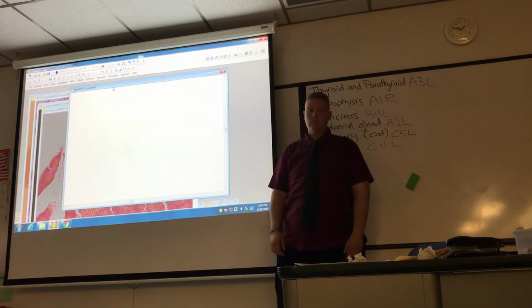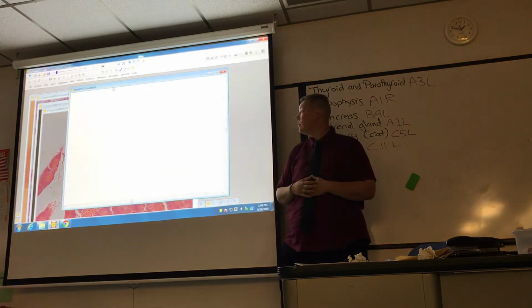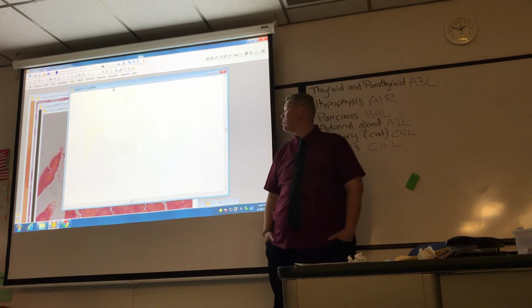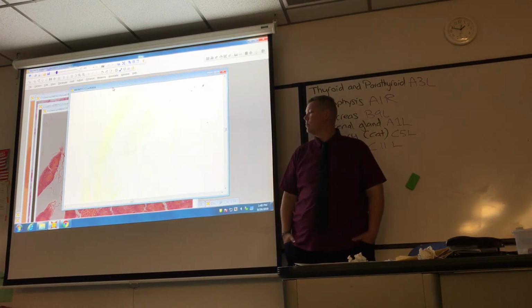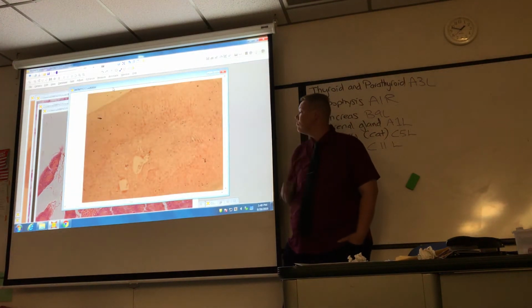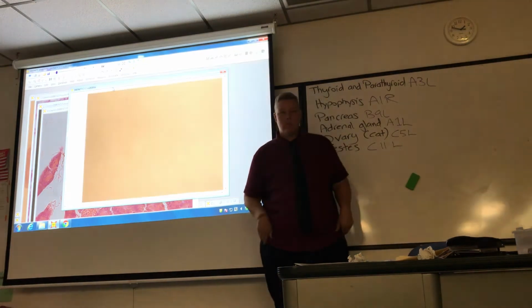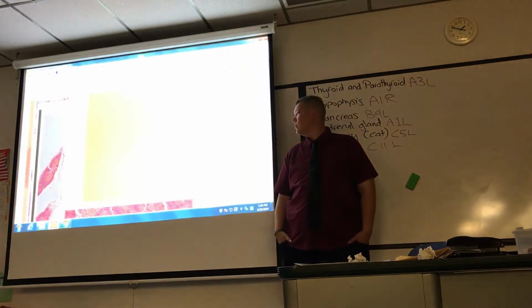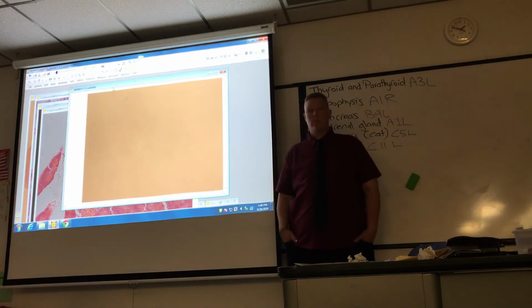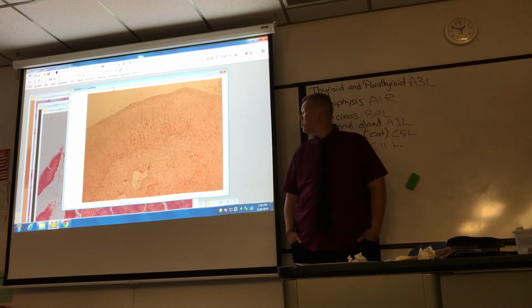Moving on, adrenal gland. A lot of dust on there. Let me clean this up. Got most of it off. Okay.